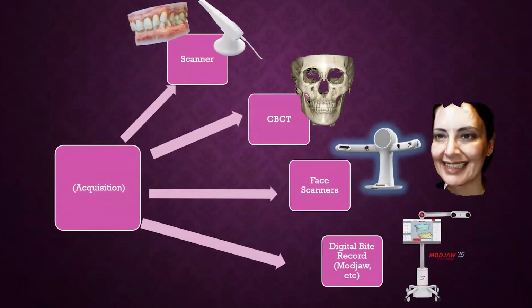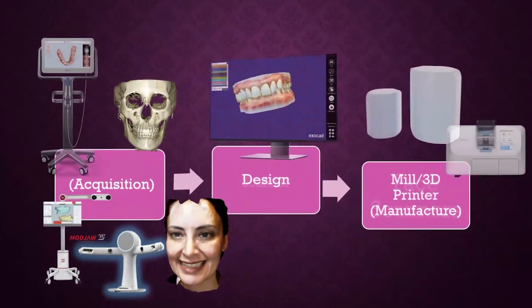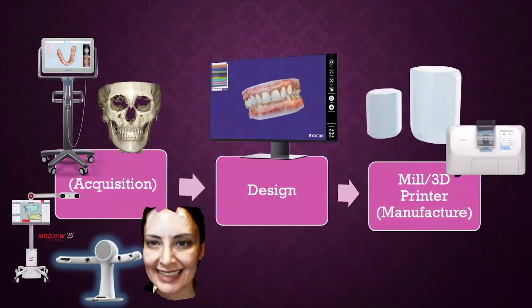We're talking about CT scans. We're talking about face scans. We're talking about digital bite records. There's a lot now that goes into just the acquisition part of capturing the data. So we're going to focus on how that works in our day-to-day.